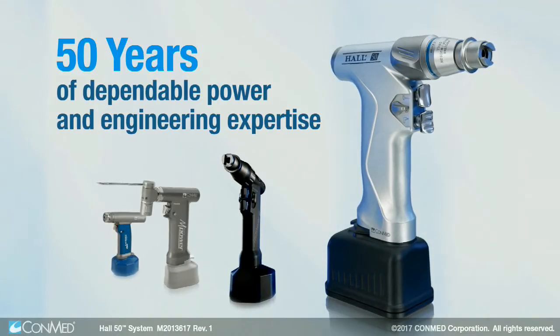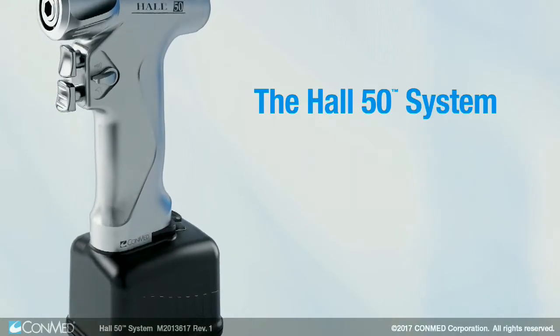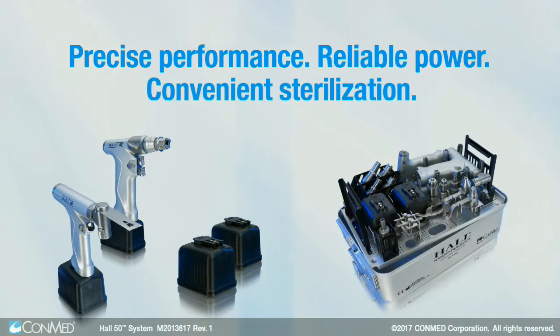Built upon 50 years of dependable power and engineering expertise, the Hall 50 system delivers unmatched value, combining precise performance, reliable power, and convenient sterilization into one solution.